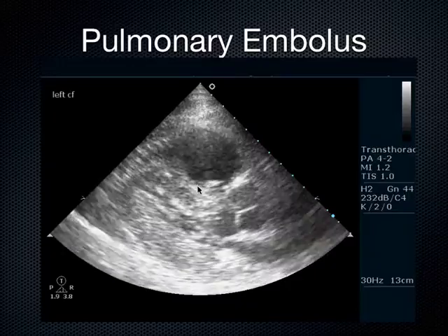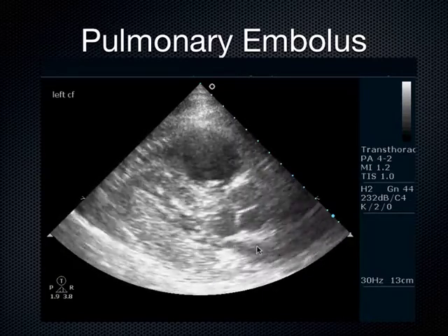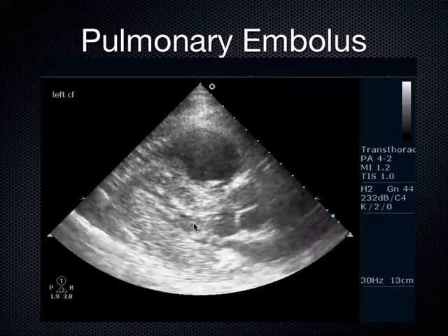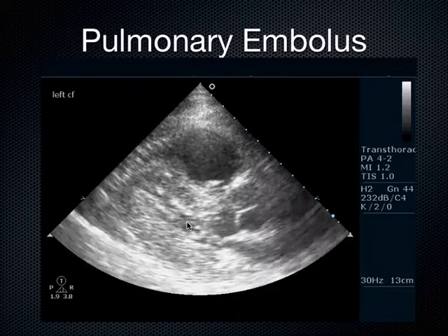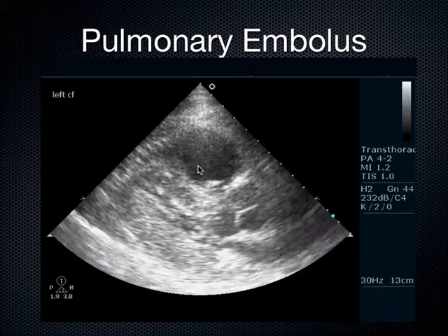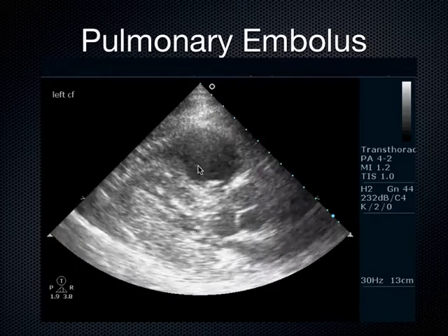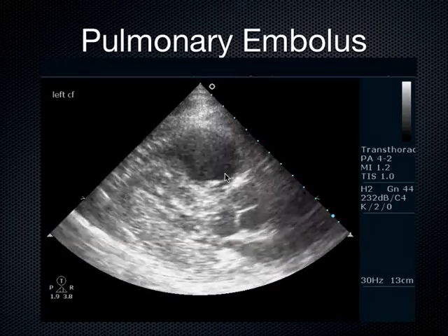Here's another patient here. What axis of the heart is this? Parasternal long. I know it's a little funky to look at because things are a little squished here, but that's the parasternal long. We see essentially an empty left ventricle and a big right ventricle in the setting of pulmonary embolism. In this patient, I would definitely think about pushing thrombolytics, and obviously they're in shock. They've got a big RV, and in this case, they're coding. Doesn't hurt to push the thrombolytics.